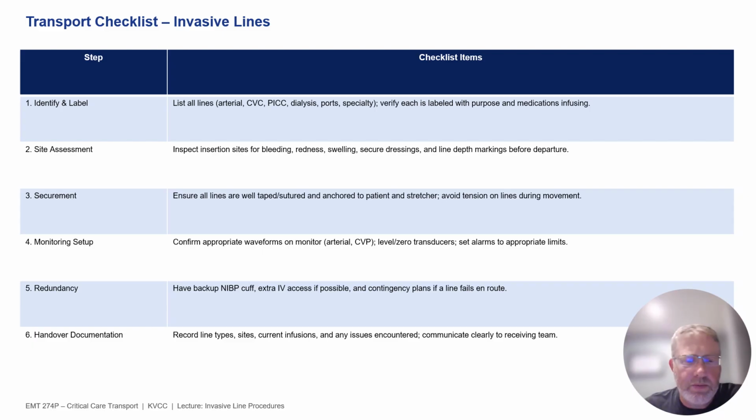They're not always the primary focus, but if anything goes wrong, then they will become the primary focus. So this checklist is a pre-departure kind of ritual for every patient with invasive lines, and I encourage all of you to make it yours.